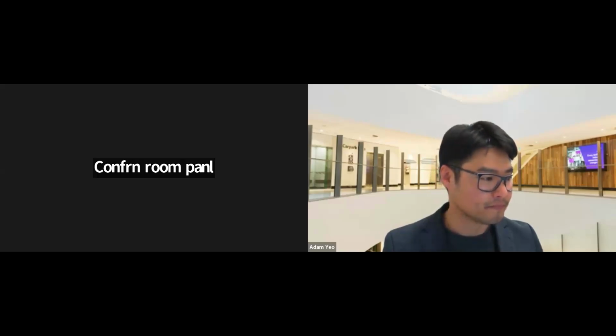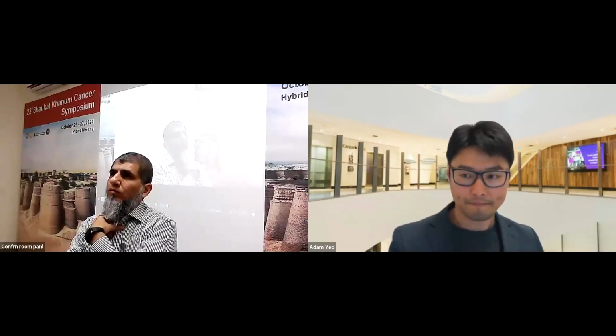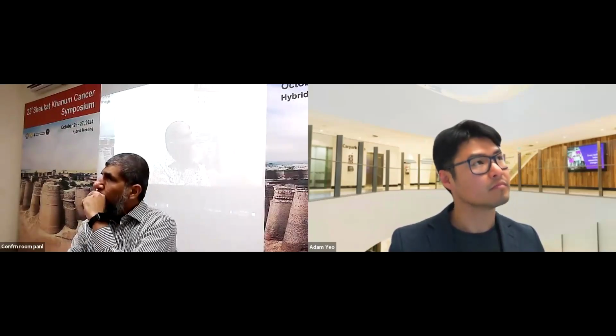All right, one last question from the audience. My question is regarding LINAC-based SRS or SABR. Let me tell you about our experience at our institute. When we are treating the patient, before treating we take the MV/KV image and then the CBCT, and the MV/KV shifts are different from the CBCT shifts. What is your experience at your center? How do you treat the patient, and how do you take the imaging before actual treatment?